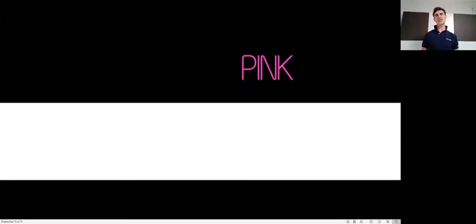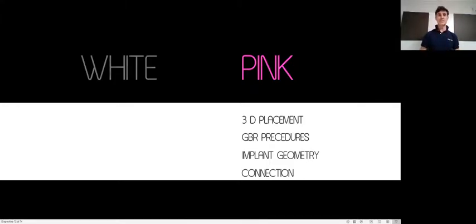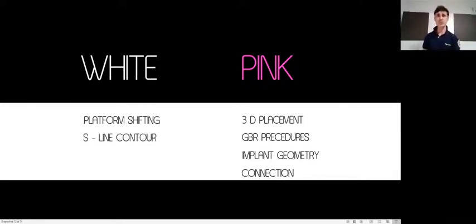So we tried to satisfy this patient by respecting the rules of the pink aesthetics, the 3D placement of the implants, and the good GBR procedure performed with a good implant geometry selection, and with a good implant connection system, and the white aesthetic rules with a good platform shifting for the implant, an S-line contour allowed by our dental technician, a good retention system of the prosthetic components, and a good ceramic manufacturing, right?